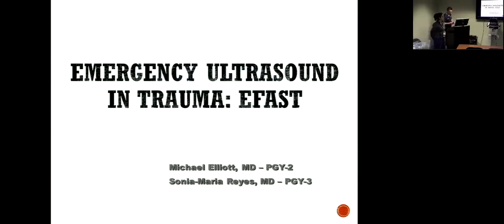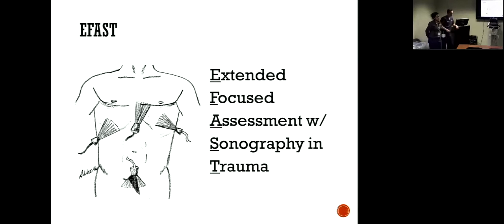So trauma for us is very algorithm based. Basically, patient comes in, ABCDs, a whole 9, and then if it's a blunt trauma versus penetrating trauma, we want to see if this person's bleeding, do they need to go to the OR? So that's where we're at with this. Yeah. So what we're trying to do is figure out what are some possible ways we can use ultrasound for you out in the field.